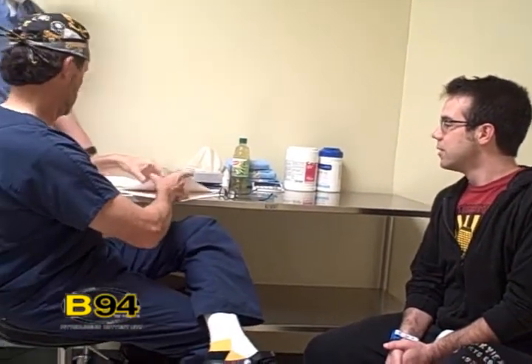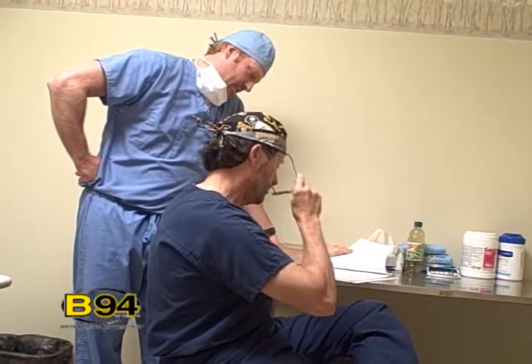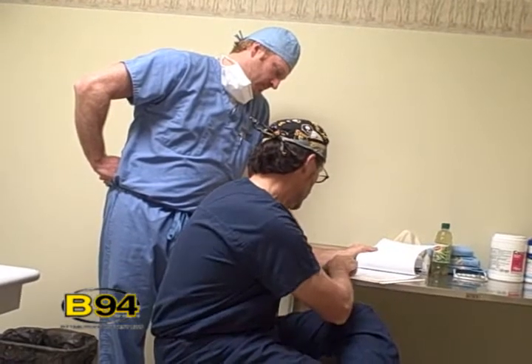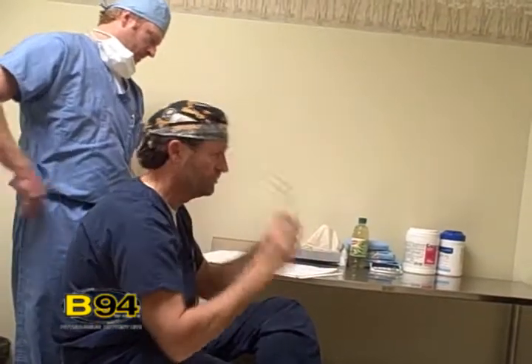This is Dr. Thomas over here. How are you doing? Are you excited? I am, very excited. You're going to be more excited as soon as you get up off the table. It'll be revolutionary for you because you are — how nearsighted? Seven, eight? Yeah, he's in the seven range. You are very nearsighted. I don't wear glasses for driving but I do wear them for reading. You'll need reading glasses too, but in about 20 years. Right now you don't, and hopefully during that time interval you won't need them at all. I think you have an excellent, better than 95% chance of seeing 20/20 with one treatment for the duration.